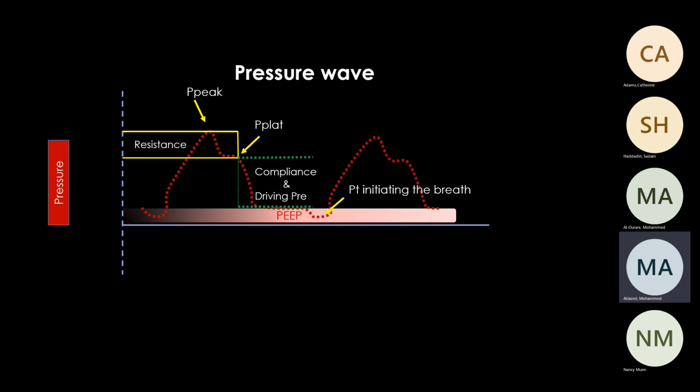All right. In this waveform we can see the baseline going down a little bit, and that's what we said. We know the patient is trying to trigger the vent, and that's the patient initiating the breath.